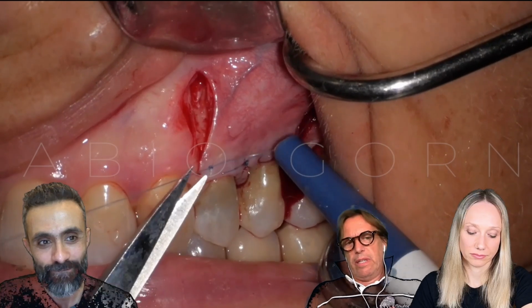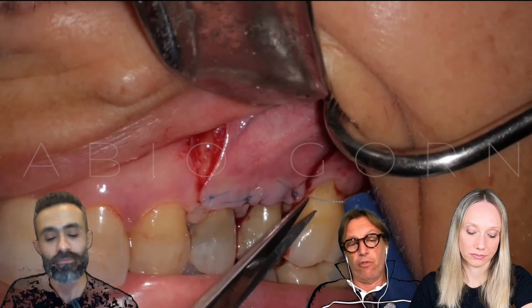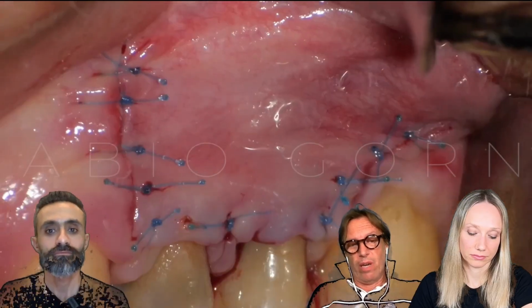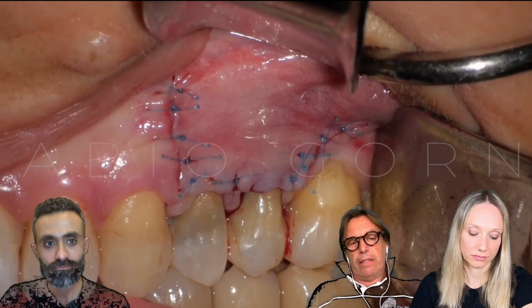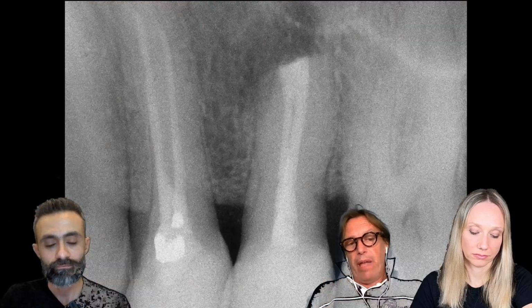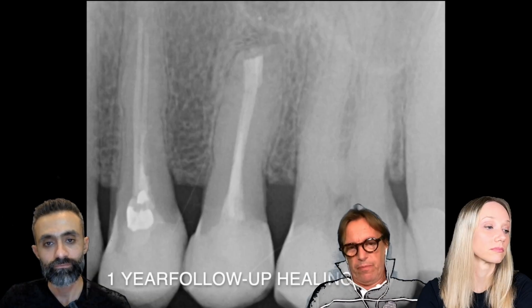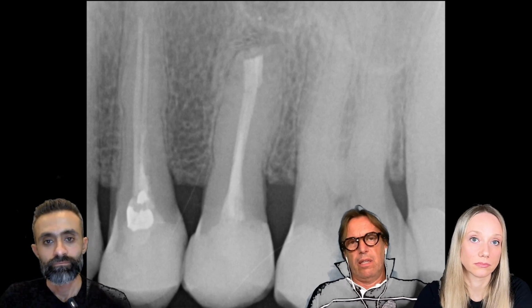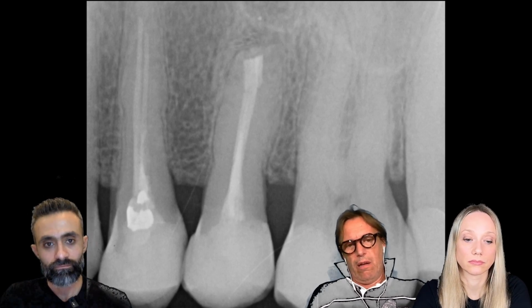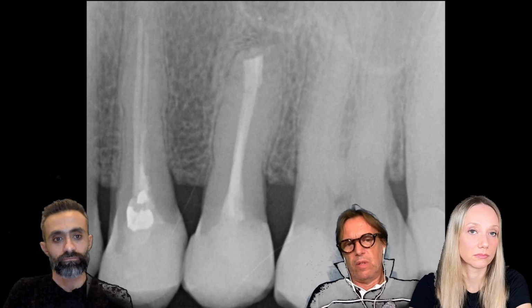The suture is important for the soft tissue management, of course, not for the final success rate of the endodontic surgery. The final result depends mainly on the flap incision. When the flap incision is precise, we can suture everything with good precision.